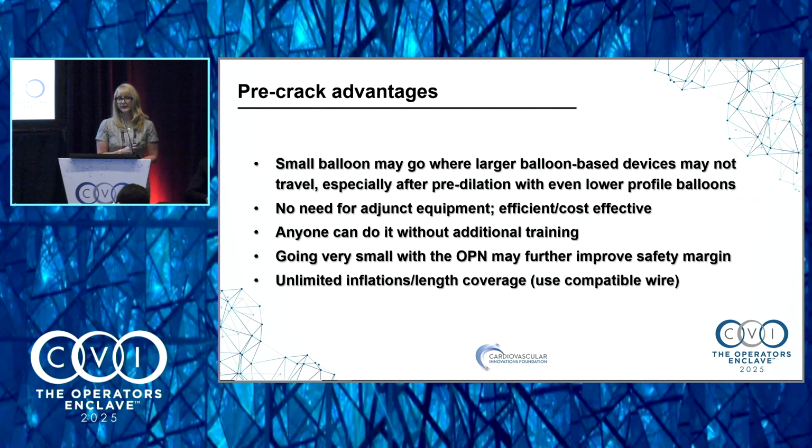So ultimately, in terms of the pre-crack technique, for advantages of it, well, small balloons will sometimes go where larger balloon-based devices may not travel, so that can be a potential advantage, especially after you potentially dilate initially with low-profile balloons like Takiro or Sapphire. You don't need any adjunct equipment here.